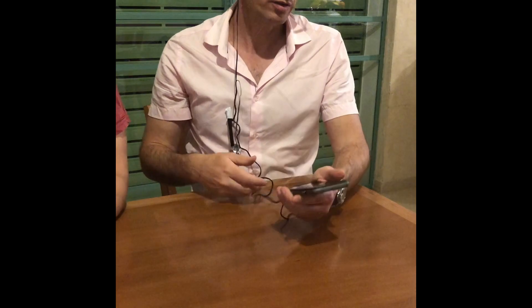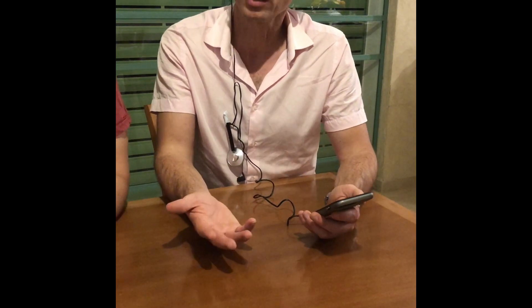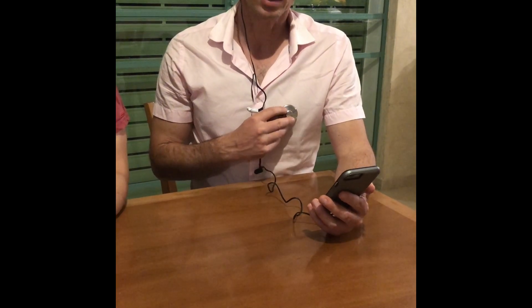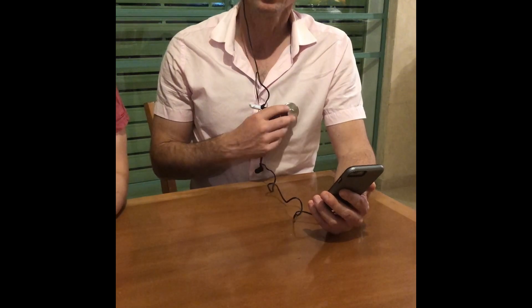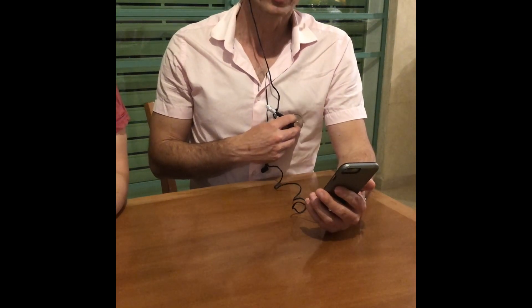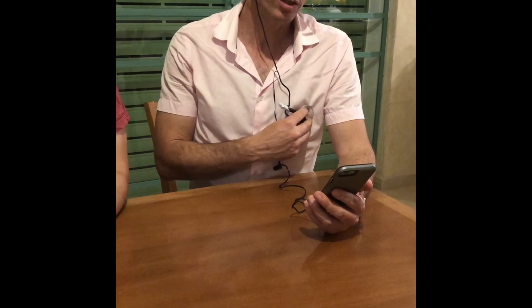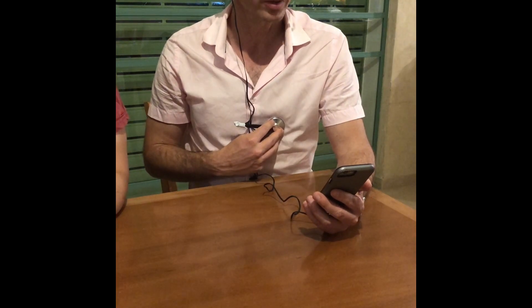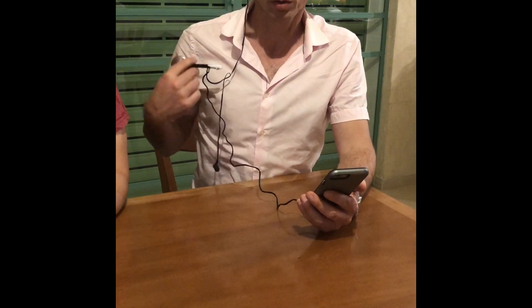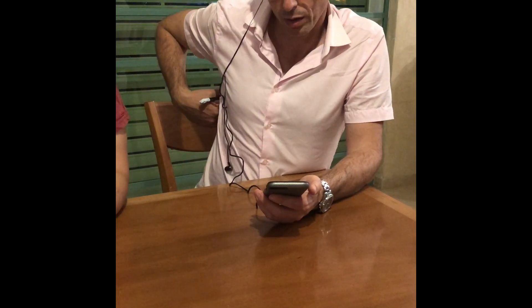At first we put the earphones in our ears and talk to the doctor. After the beginning of the conversation, we get to the physical examination. At this stage the doctor can see how we are using the stethoscope and will direct us where to put it and how to breathe, and he can hear what the stethoscope is hearing. He will tell me to breathe in and move the stethoscope left, right, up, or lower, and also direct how to auscultate the lungs from the back.